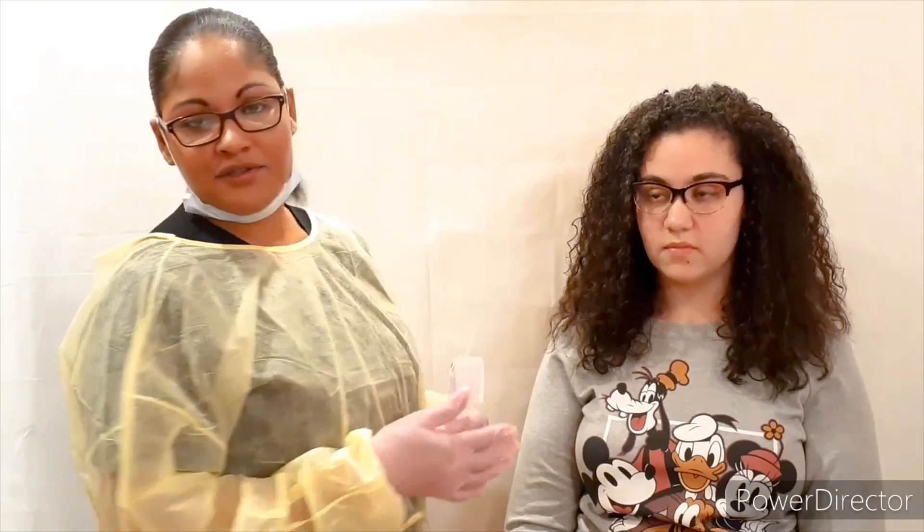Today, I'm going to show you how to do a strep test. This is used to diagnose bacterial pharyngitis, and it's caused by group A streptococci, also known as strep throat.